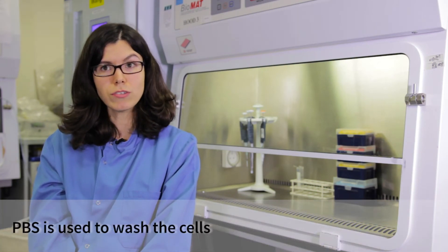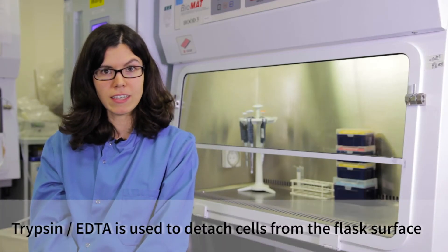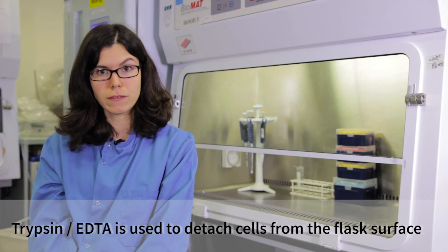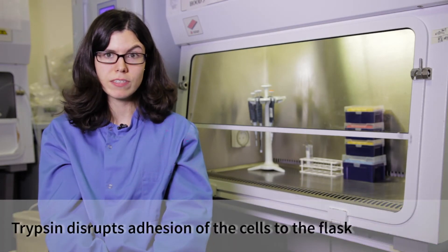The PBS, phosphate buffer saline solution, is used to wash the cells. Finally, we use trypsin EDTA to detach the cells from the plastic surface. Trypsin is a protease enzyme that digests proteins after the amino acid lysine or arginine. It breaks adhesions to the plastic surface of the flask.